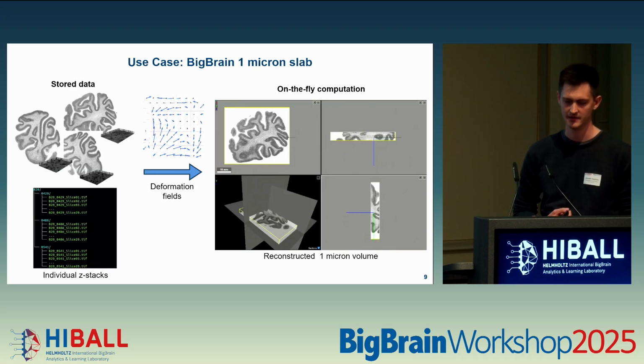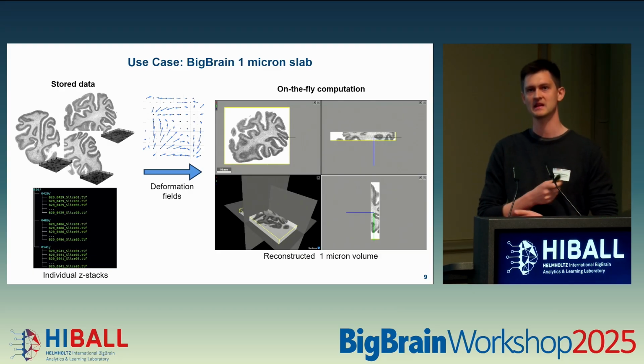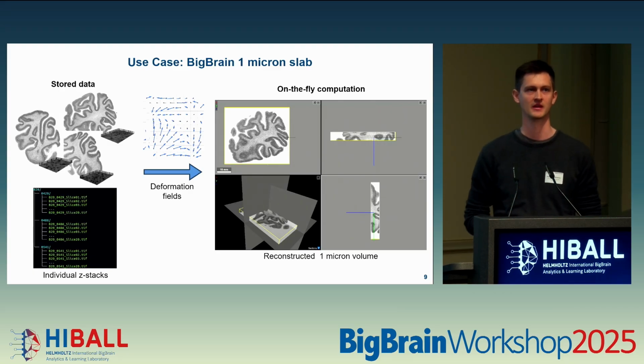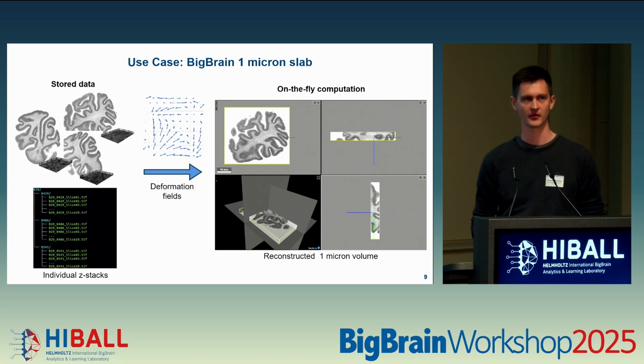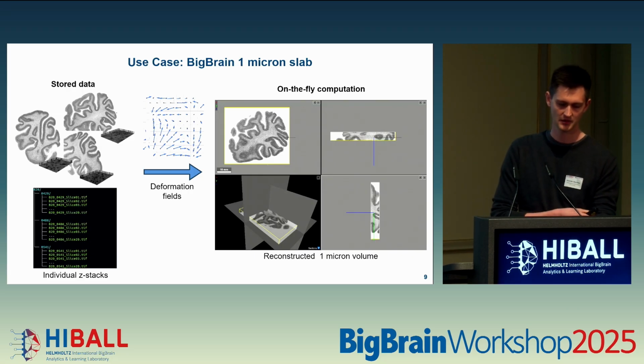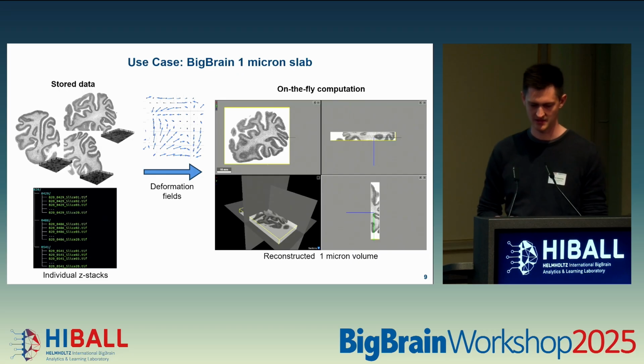And as a last use case, if we think of 1 micron reconstruction of a whole brain, we easily beat the 1 petabyte range. And we cannot, in the development process of the 3D reconstruction, each time we have an optimized reconstruction, recreate the whole volume and store it somewhere for visualization. So here the idea is to use the original scanned data, provide it with the deformation fields, and also perform the 3D reconstruction just in time.